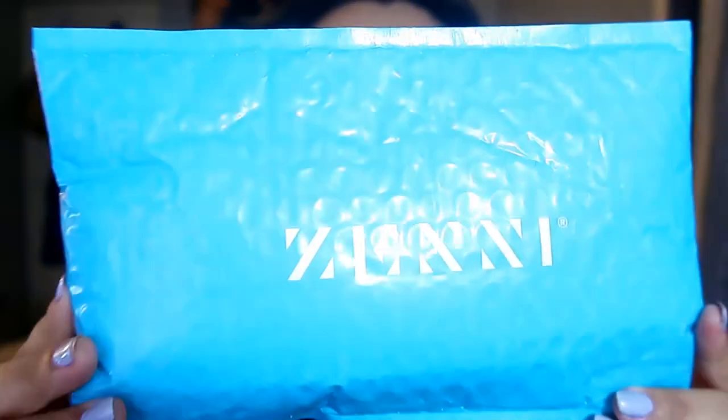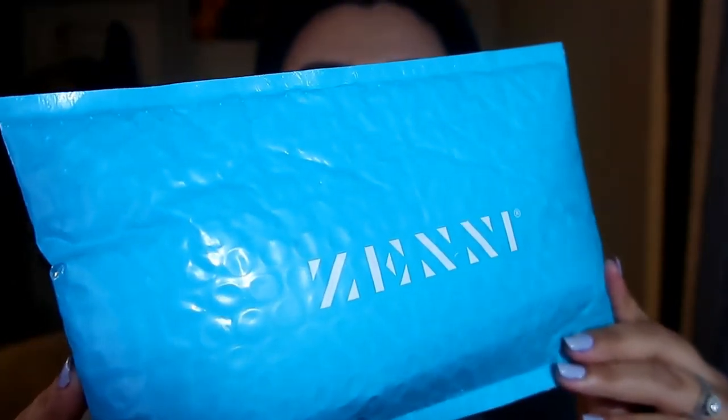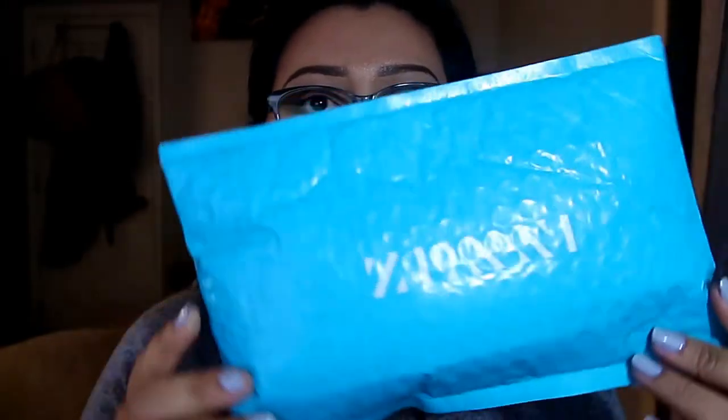So let's move on to Zenni Optical. I still haven't opened it. It comes in this kind of tealish color — it's coming up a little bit more blue on camera, but it's a tealish color in person.